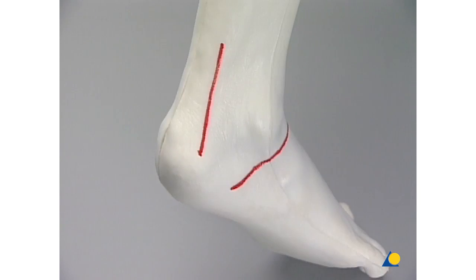In this exercise we will not use the posterolateral approach which runs vertical and parallel to the heel cord, although this approach is very useful when posterior anterior screw fixation is chosen.